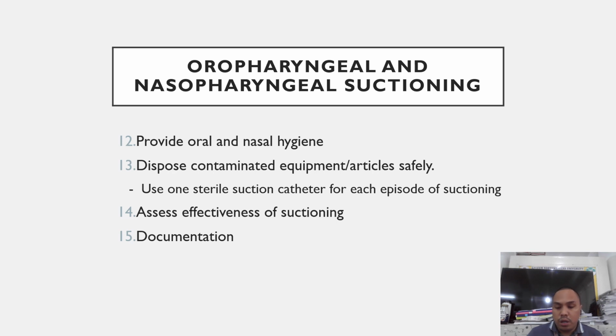And then we need also to provide oral and nasal hygiene, and then dispose contaminated equipment articles safely. Use the sterile suction catheter for the episodes of the suctioning and assess effectiveness of suctioning. And lastly, we need to do documentation.